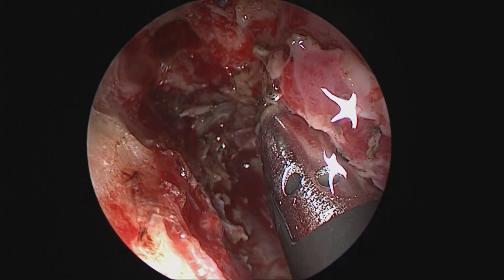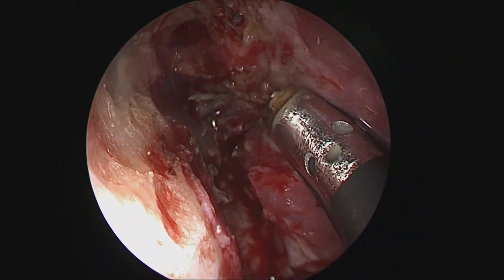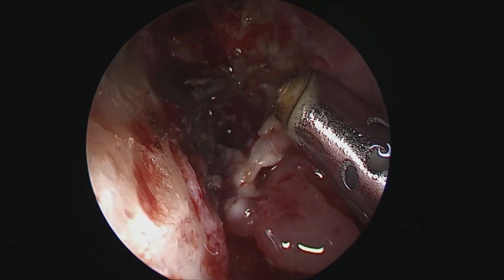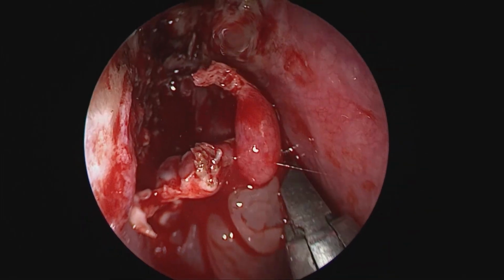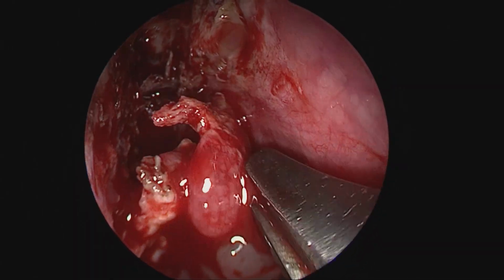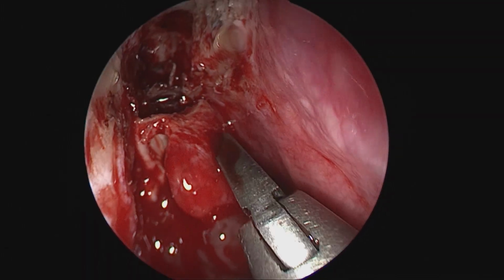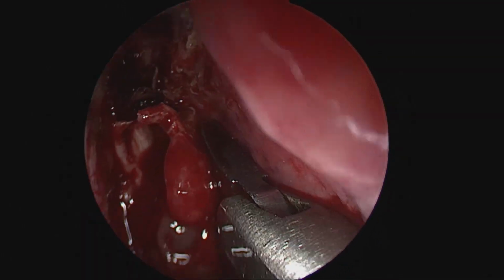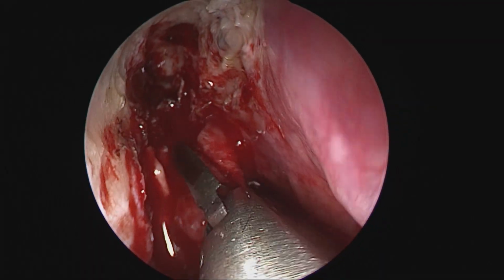So as you see, most of it has been removed. Now the portion of it attached to the septum is being cleared, and once that is done, along with the remnants of the middle turbinate, this would be resected as one complete portion of tissue that will be submitted for histopathology.